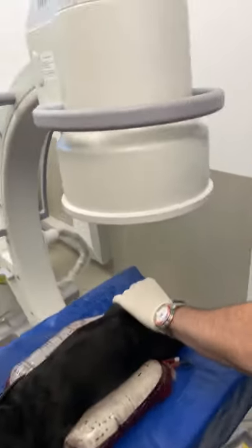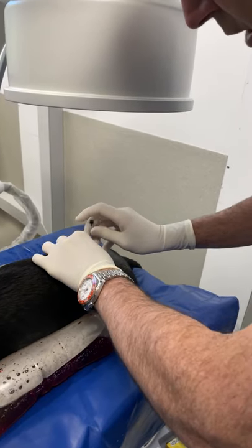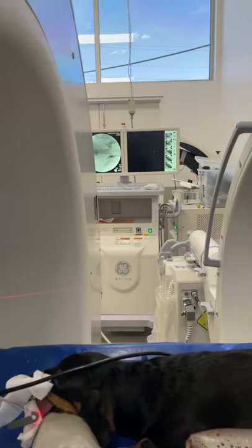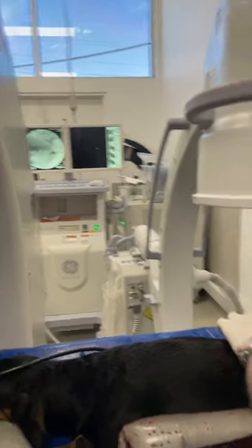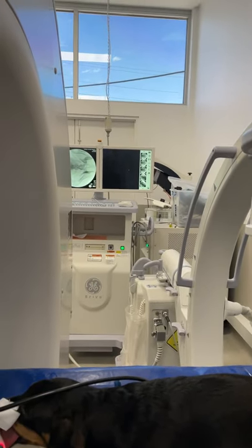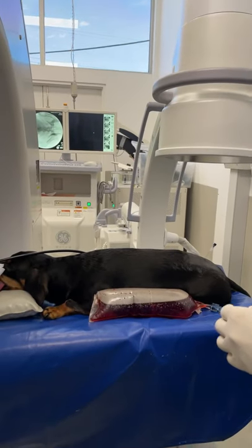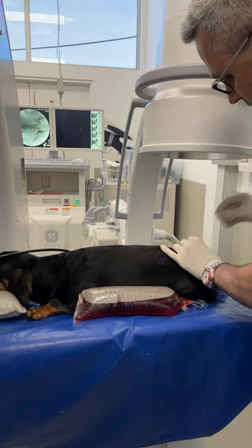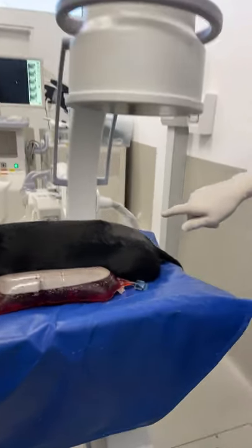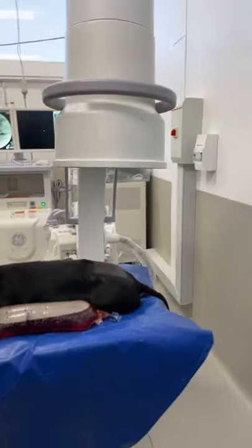I'm feeling the dorsal spine or the spinous process of probably L5, and I'm pinching the spinous process and going just cranial to it, going pretty much vertical to the skin. That's quite a bit higher than I expected so we'll drop that down lower. So that is L6 and I'm going to redirect my needle into the space between the vertebral bodies. Now I've just dropped through and I'm in the spinal canal. I'll pull my stylet out and if I get CSF coming out — which I have — that tells me I'm in the subarachnoid space. That makes it easy.